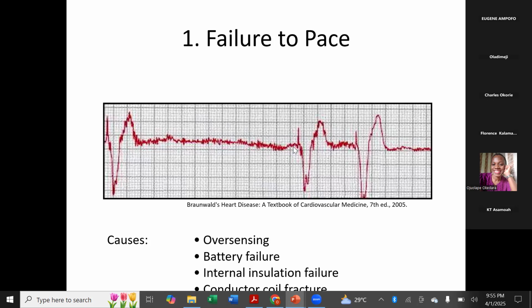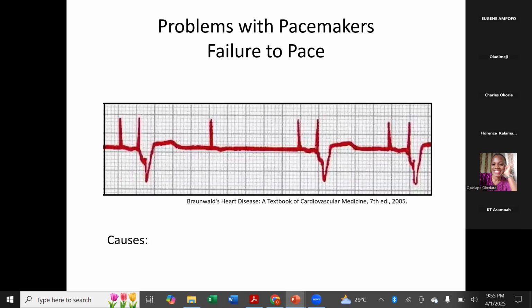So if you look at this patient, we are seeing two pacemaker spikes. So we expect one for the atrium, one for the ventricle. Then later, you see a pacemaker spike, you didn't see any activity. You see a pacemaker spike, we see another one that generates activity. So in this kind of patient, it's not capturing. So there's a problem with the lead. Either the lead has dislodged, or the thresholds are very high, and it's not capturing.